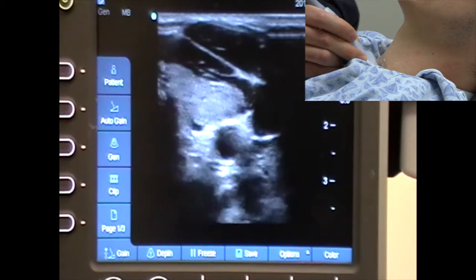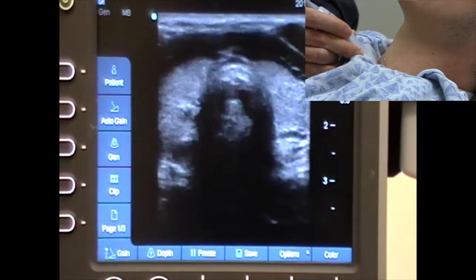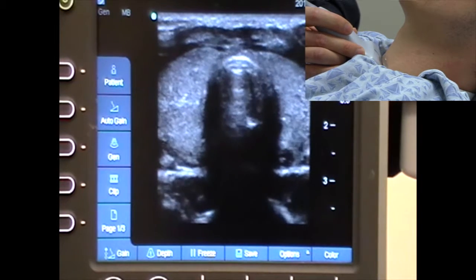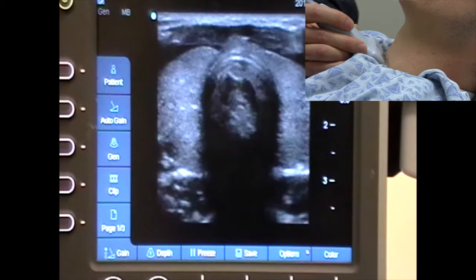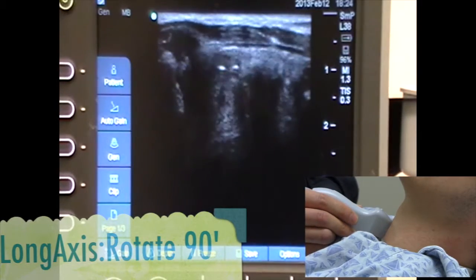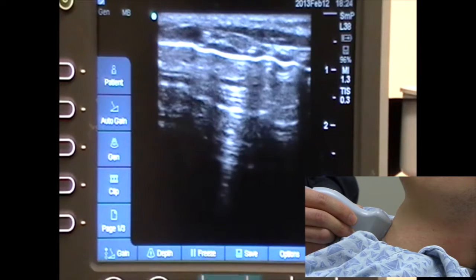I'm going to come back to midline. This is a transverse view, or a short axis view. If I wanted to get a long axis view, I'd come back and turn the probe 90 degrees — as you've learned — to get a long axis view of this structure.